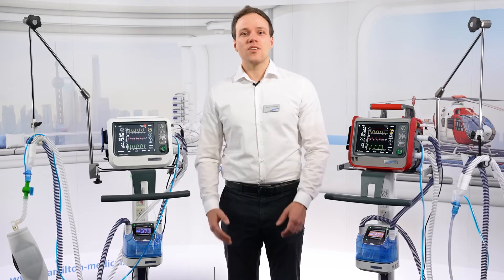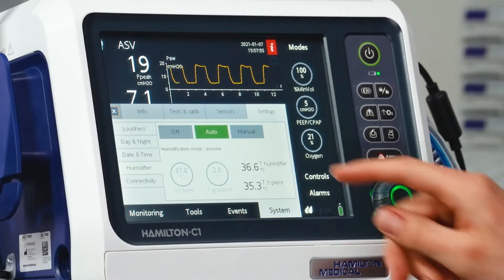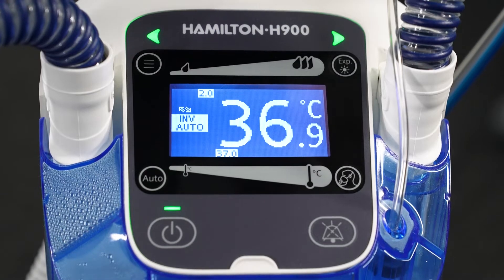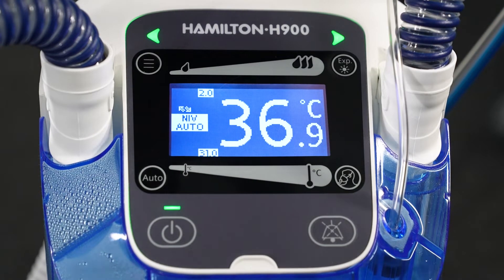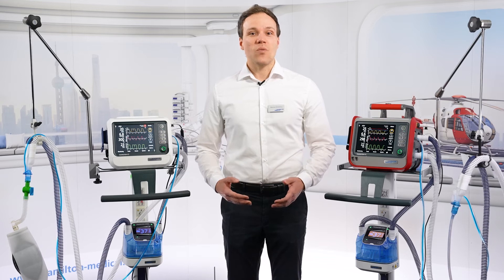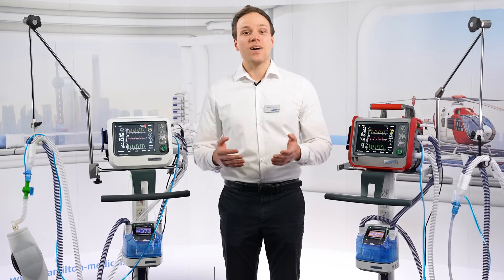In addition, the humidifier synchronizes with the ventilator status. So if you switch from invasive to non-invasive ventilation, for example, the humidifier automatically does the same. This also means that when the ventilator is put into standby, the humidifier will go into standby automatically as well.